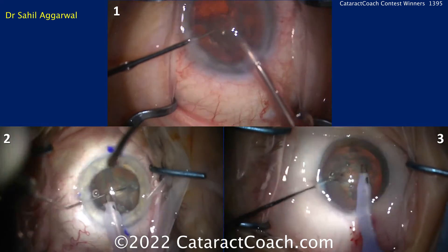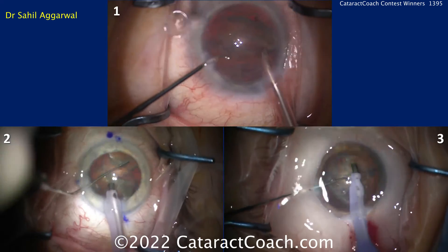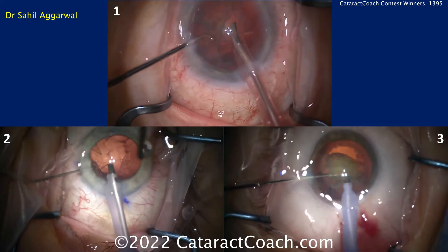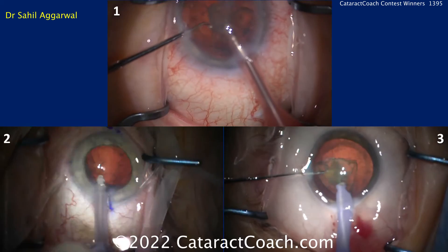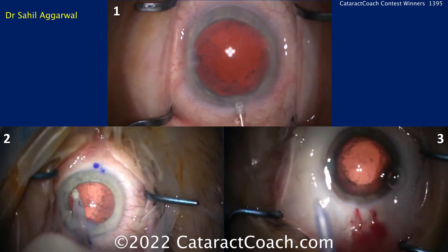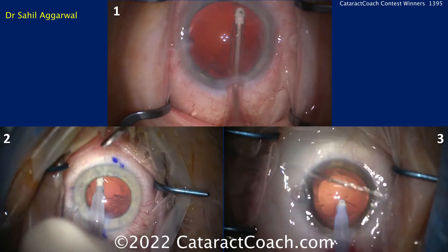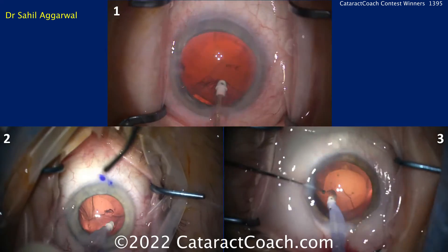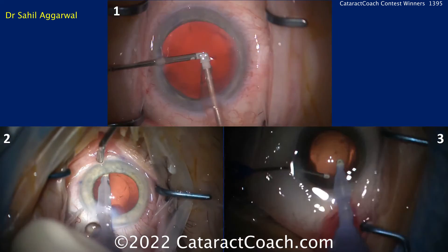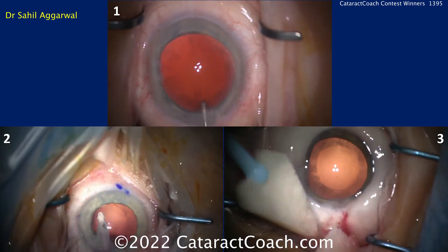I've been very fortunate at Duke — we get to try different types of instruments and different techniques for doing the surgery, so it's been a great experience. In panel three, I'm starting to bowl out the lens; the conjunctiva is starting to balloon and there's a little subconjunctival heme forming, but eventually I was able to get a piece of the lens out. Now we're going to transition to I&A — trying to get the cortex out in all three panels. Not a whole lot of residual cortex in panel one. In panel three, there was a small lens piece; I used the Conner instrument to break it up. For subincisional pieces in panels one and three, I used the bimanual approach; in panel two I was able to get all the cortex out without it.